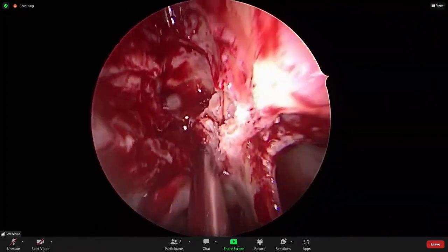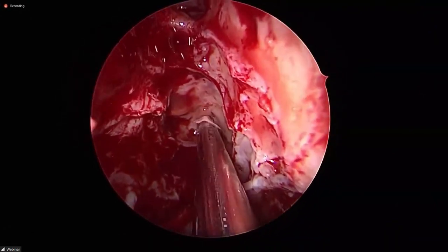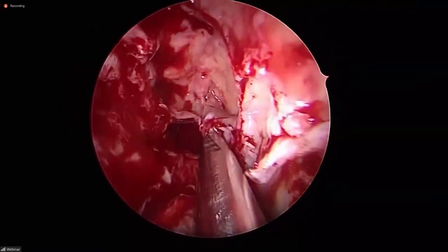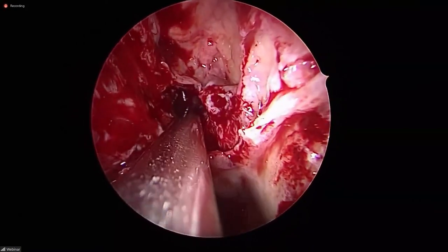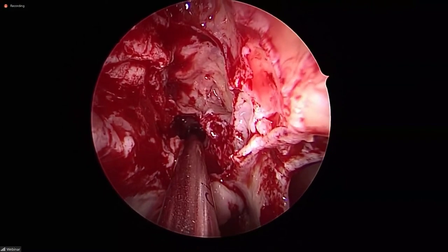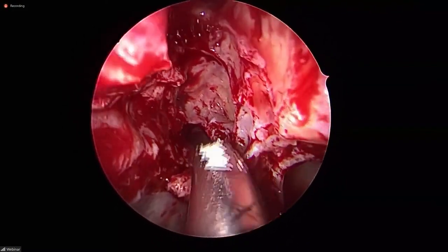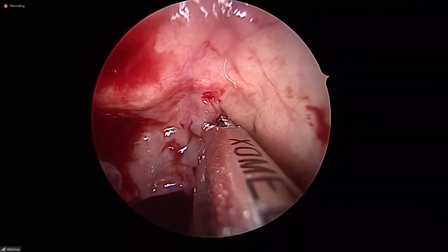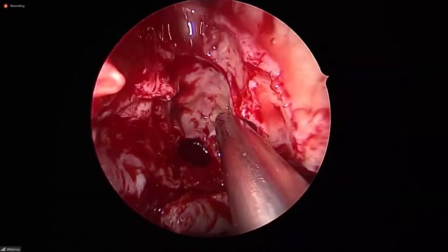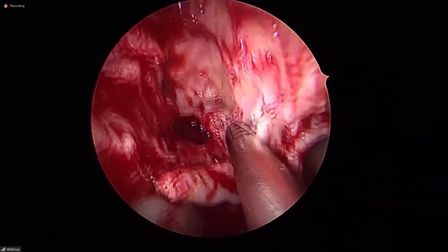See, all these post-ethmoidal cells I am removing in the end, after having opened the sphenoid sinus. So in any given situation, I don't go behind that. See this? My sphenoid is so deep. But my limit, I try to keep myself anterior to this ostium. I don't go there. That's the point I wanted to make, because if it is an Onodi cell, there it is going to be the optic nerve. See this? All flushed anteriorly, all the post-ethmoidal cells, that is all lamina.